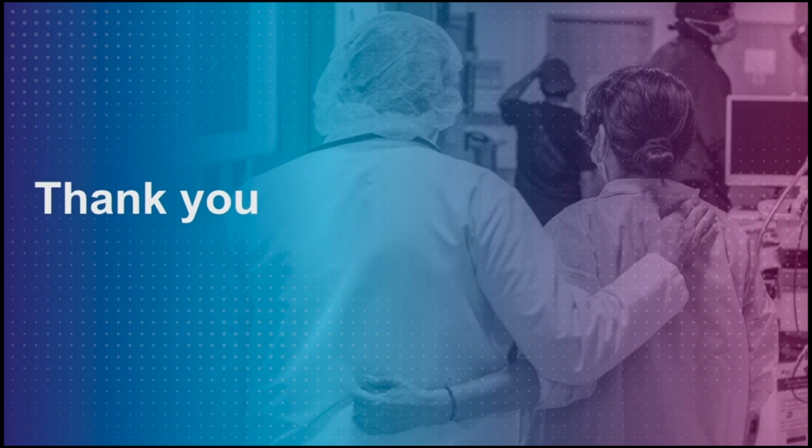SPECT, and Spencer could probably speak to this better than I can, there are a lot of differences between the equipment, right? The settings on the equipment and so forth, and the settings that we used back when we were at Hopkins, or that you're using at UNC now, may not necessarily apply to that third institution that's going to implement it. So there is a little bit of playing around and tweaking that has to be done to get this to work appropriately for you.